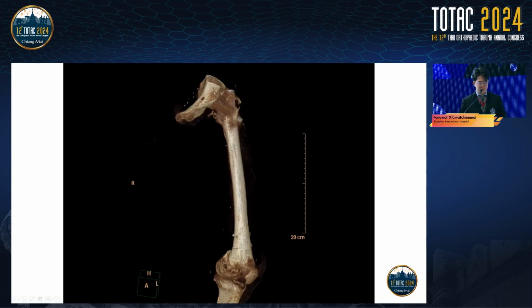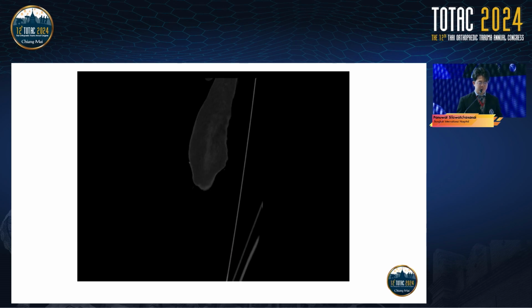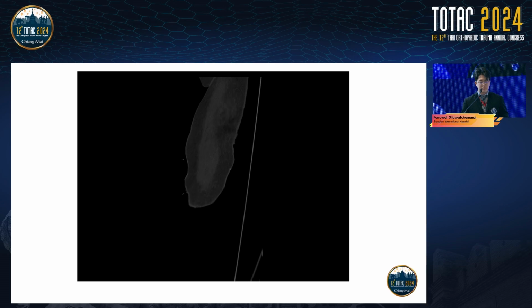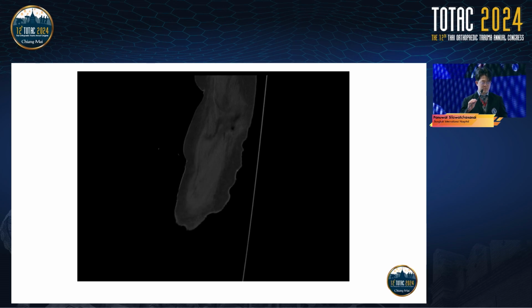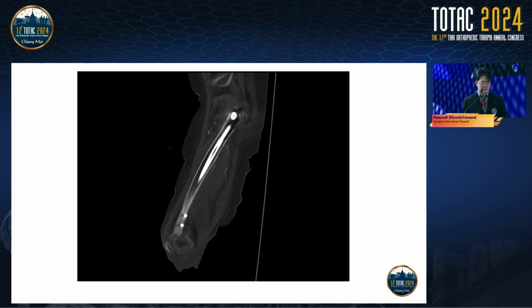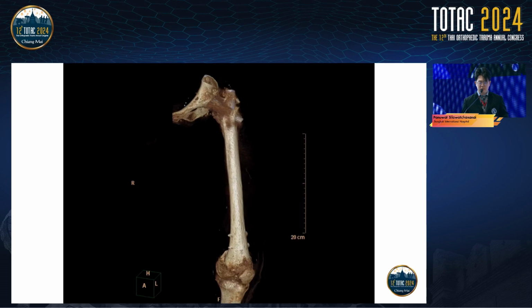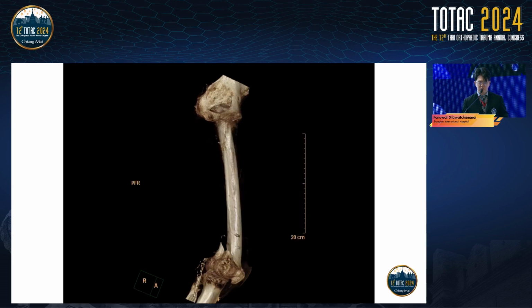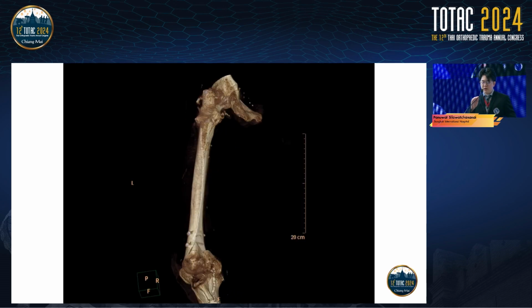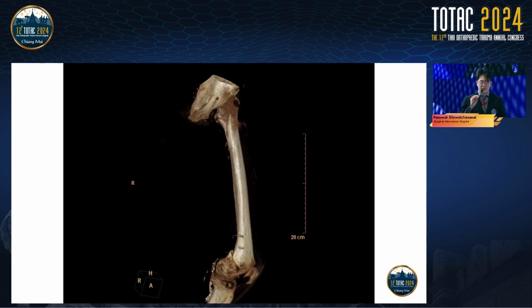Oh, sorry, go back. Okay, for a clear picture, this highlights the complexity of the fracture in relation to the implant.